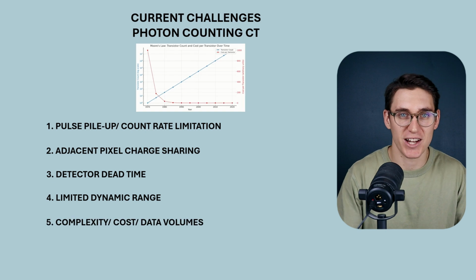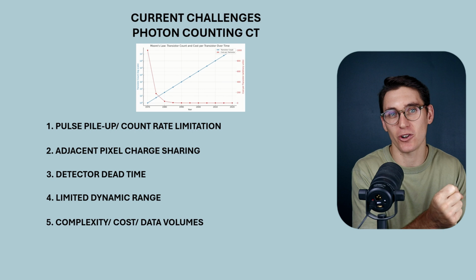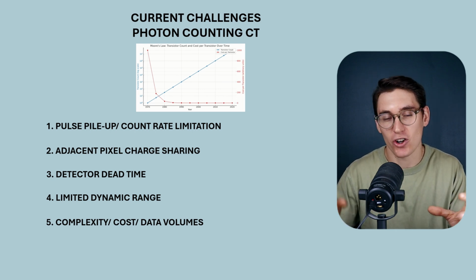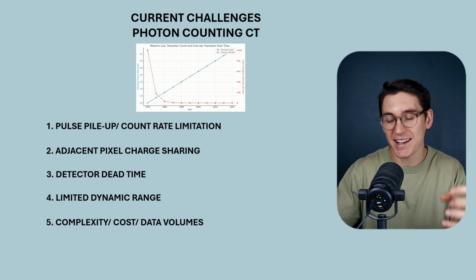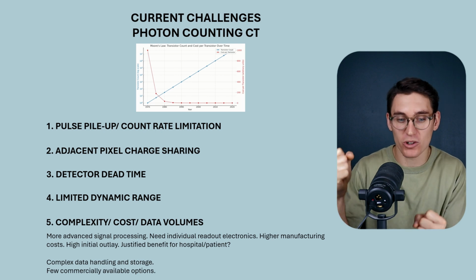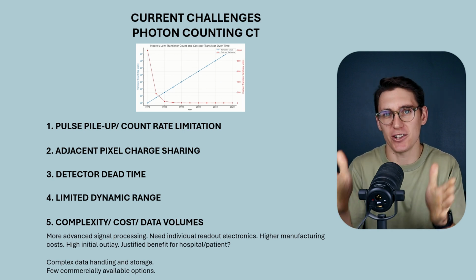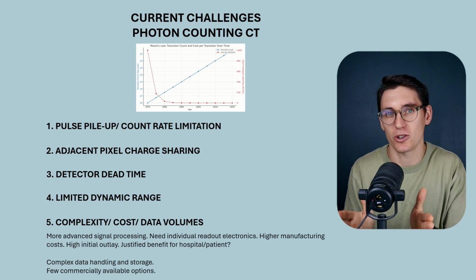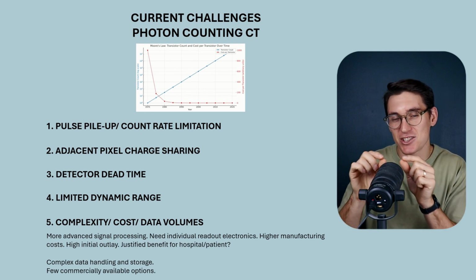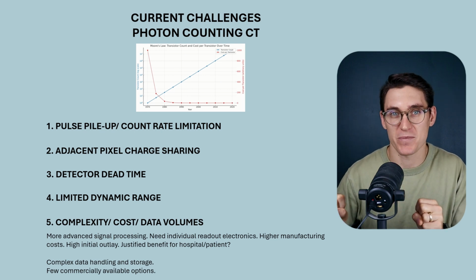And finally, the last challenge that we face is the complexity of this new technology. We don't quite know exactly all of the things that we can do with this current technology. Cost is always going to be prohibitive, and now we're getting so much more data, and that data is going to require much more advanced signal processing. That individual detector is not giving us one readout value per projection like in conventional computer tomography. It's giving us multiple readouts for each and every projection. It's not just a doubling of the amount of data, it's an exponential increase in the amount of data.